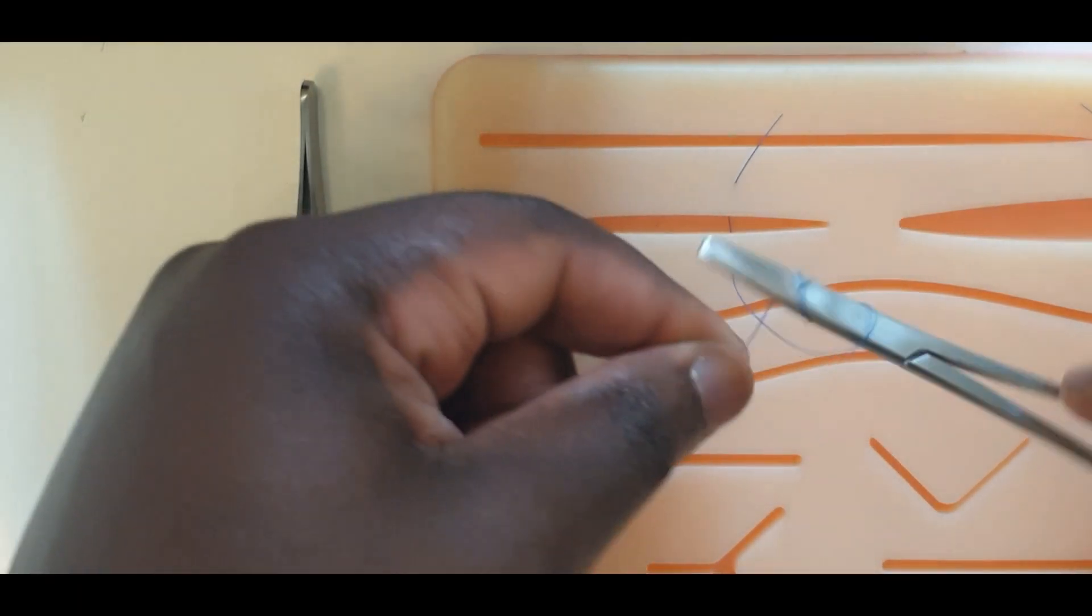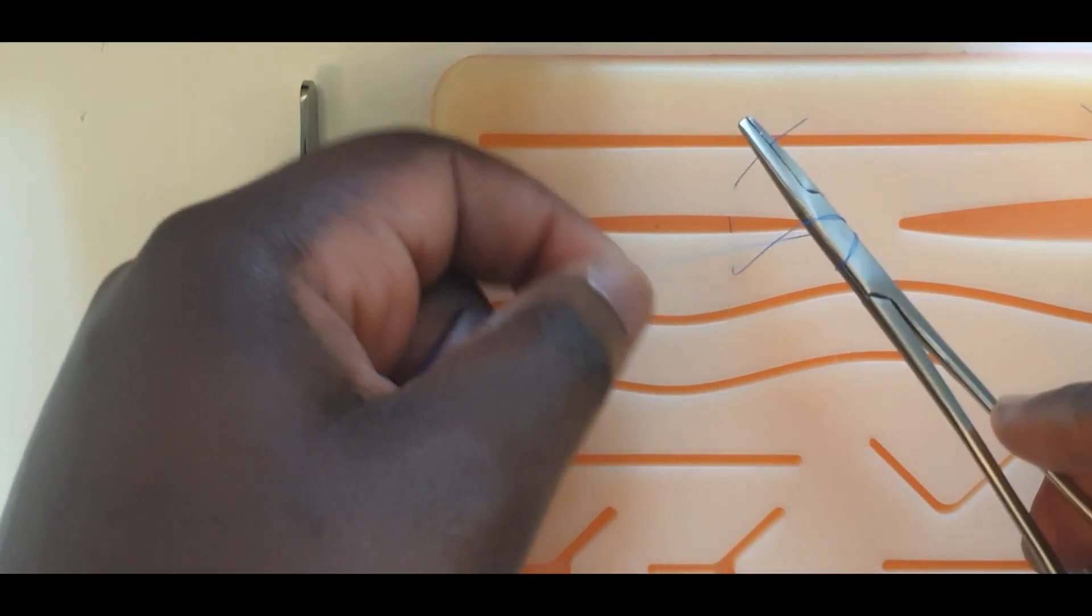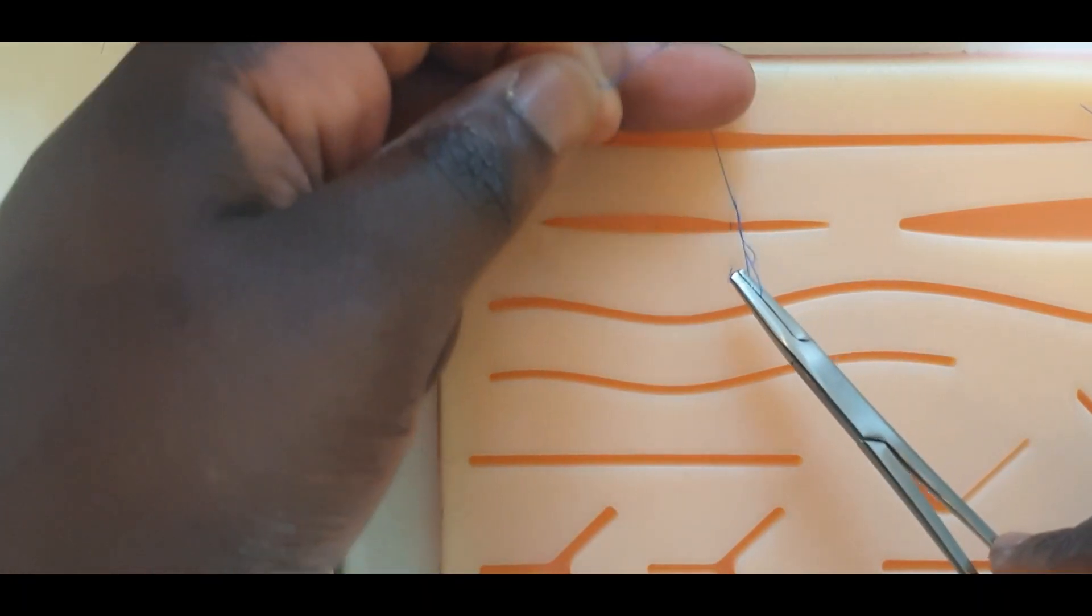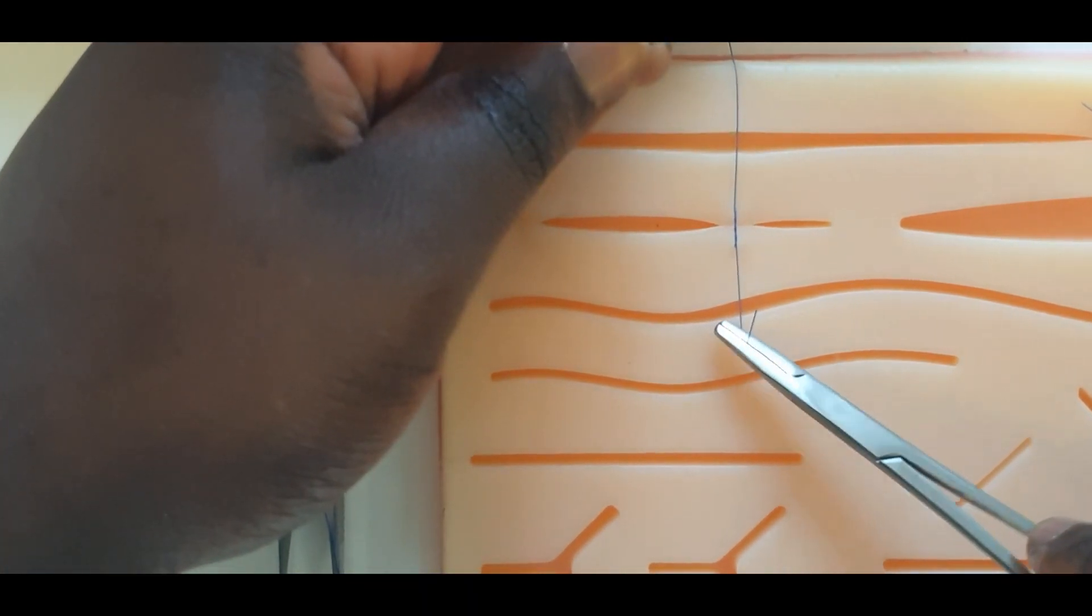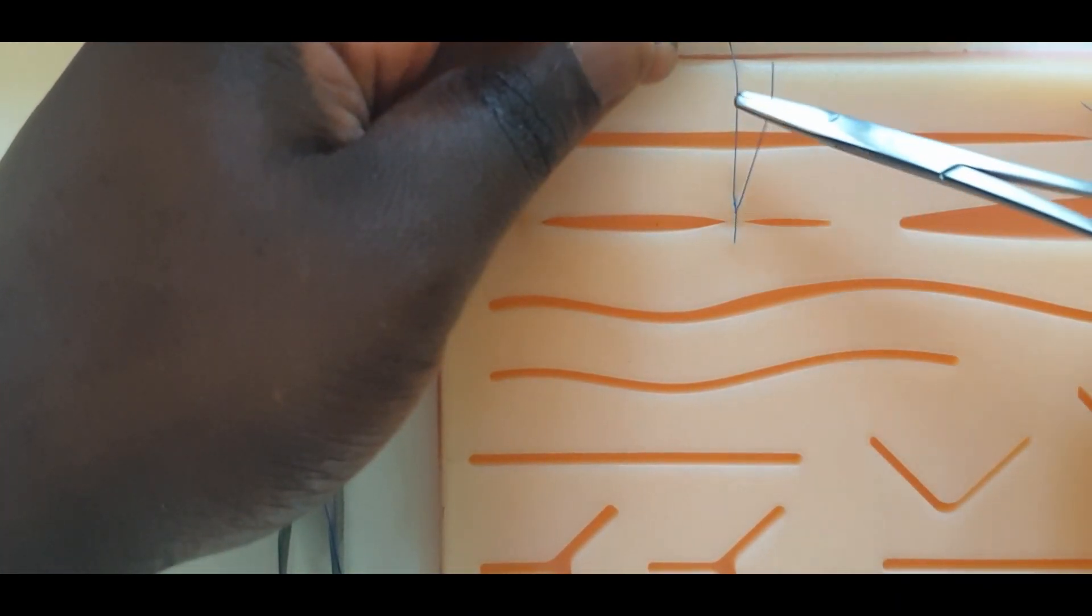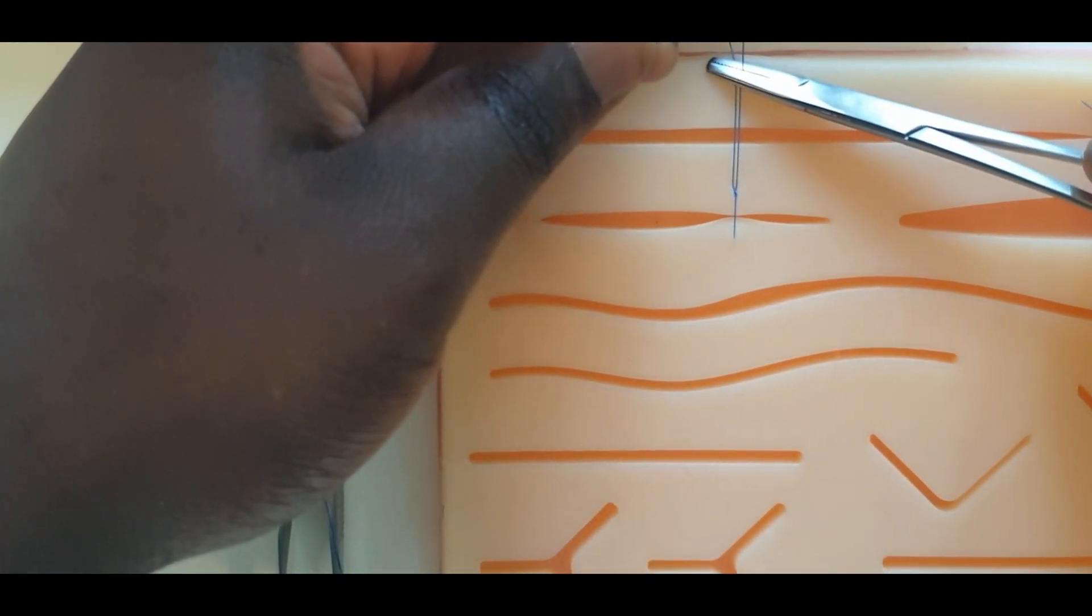This is performed by maintaining tension and position of the long suture and advancing the short thread to the same position.